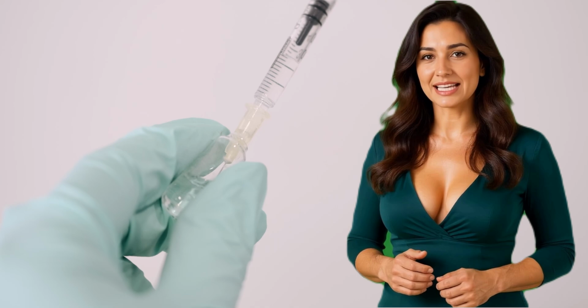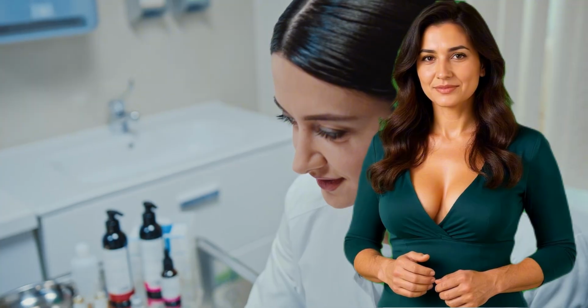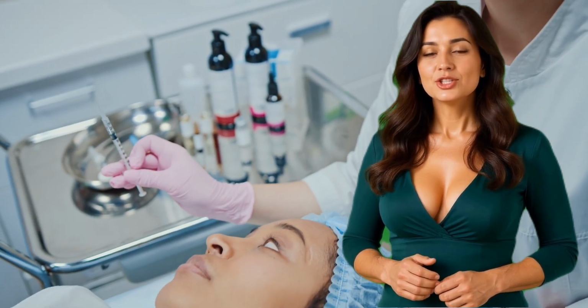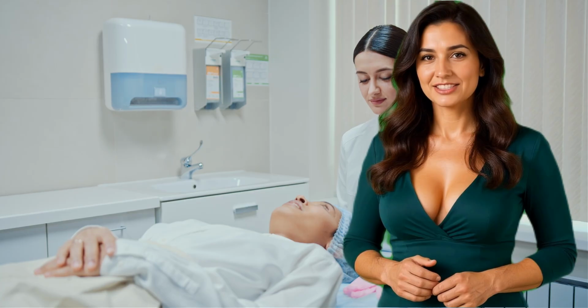After the medication has been administered, flush the intravenous line with the appropriate solution. This helps ensure the medication enters the bloodstream completely and keeps the IV line clear. Continue to observe the patient for several minutes after the procedure. If the patient develops difficulty breathing, a skin rash, dizziness, or any unexpected symptoms, respond immediately.